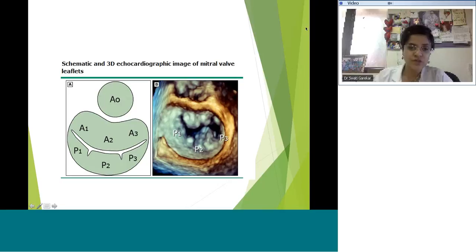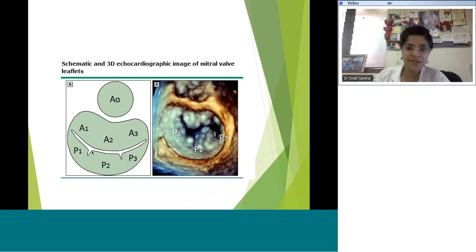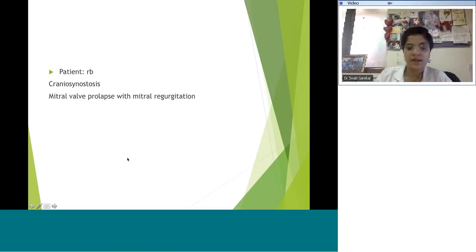Remember in the parasternal short axis view this will be inverted — your left-hand side will be where the left atrial appendage is, so A1 will actually be on that side of the screen, opposite to what the diagram shows. Let's move on to this patient, a 10-year-old with mitral valve pathology.